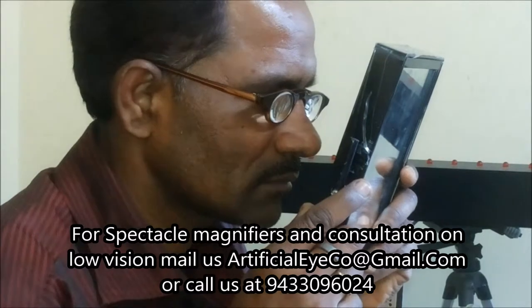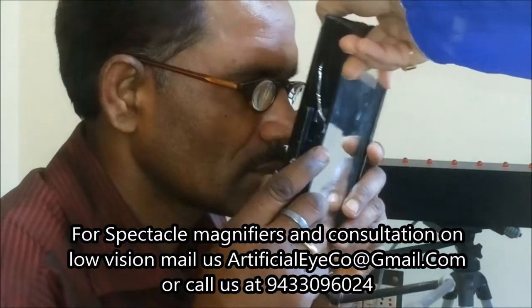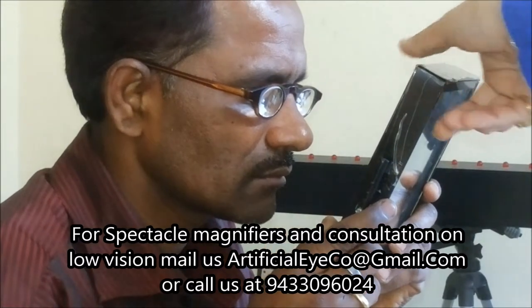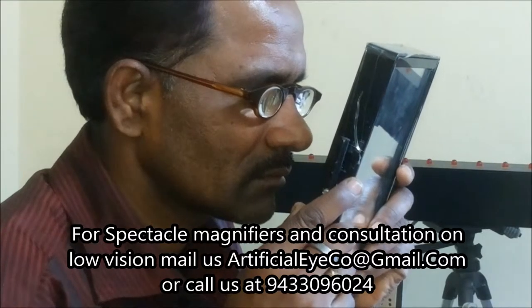If it is of high magnification, it will be clearer closer to the eye. And if it has low magnification, it will be clearer at a distance from the eye. So this is one of the good tools which all patients want to wear.